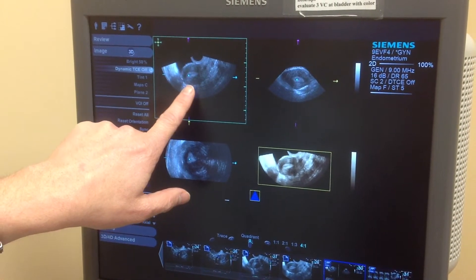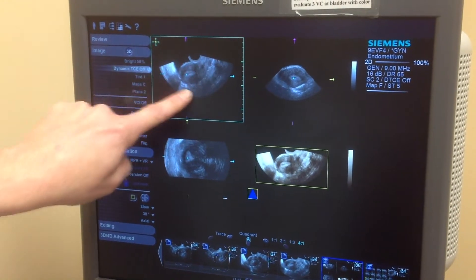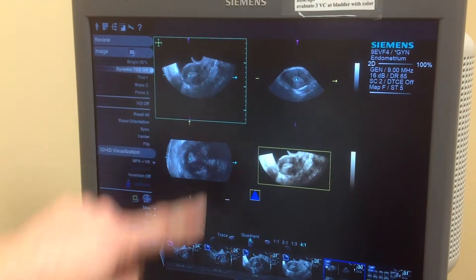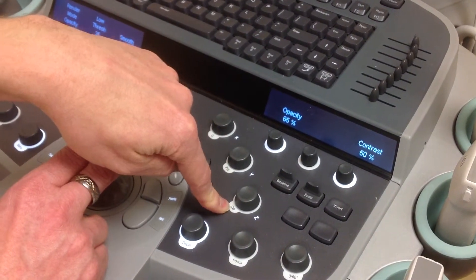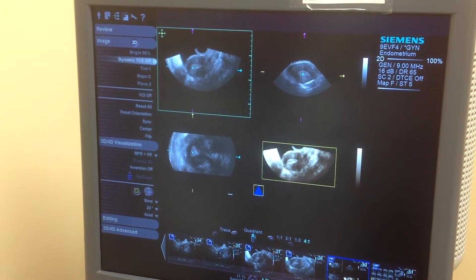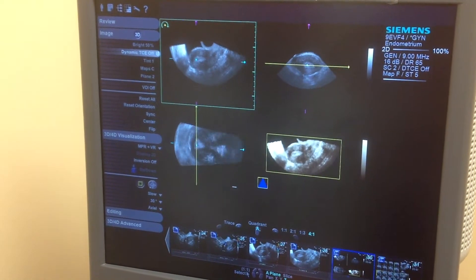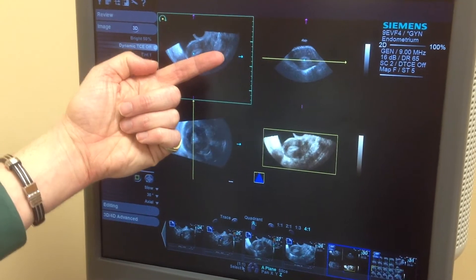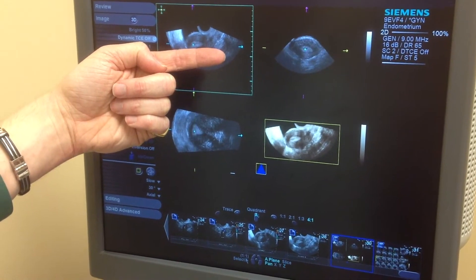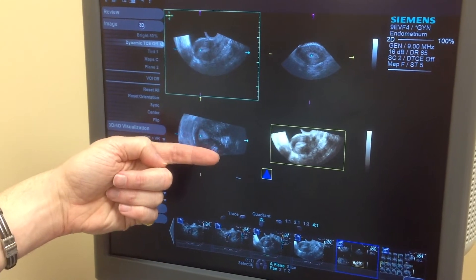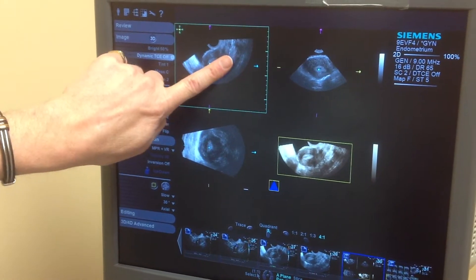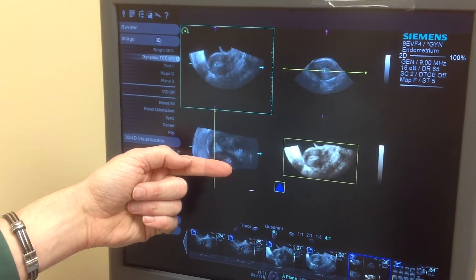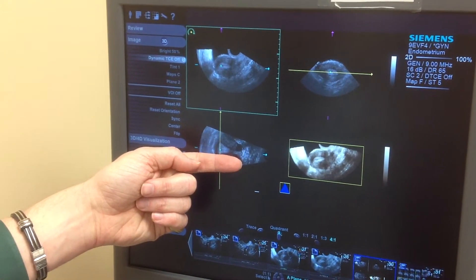The control you're going to use is the Z rotation, because Z rotation spins it like a clock. The Z control on the keyboard — you've got X, Y, and Z — is going to be your CW button. When I rotate the Z control, I can straighten out my endometrium. If it's tilted, I can straighten it out by rotating that control. As I rotate it into plane, you can also see the coronal plane starting to change — the whale's tail we're looking for starts to appear in the image.